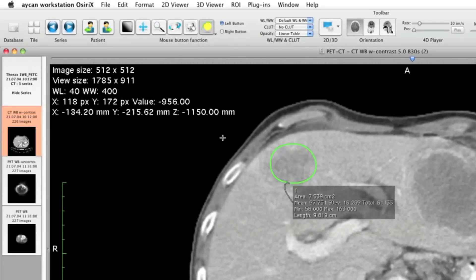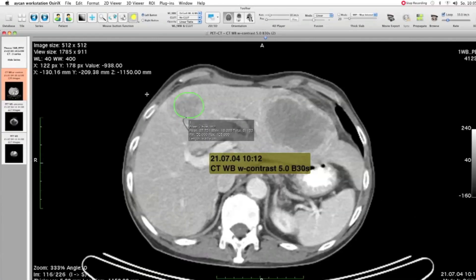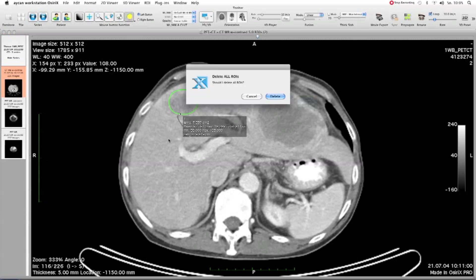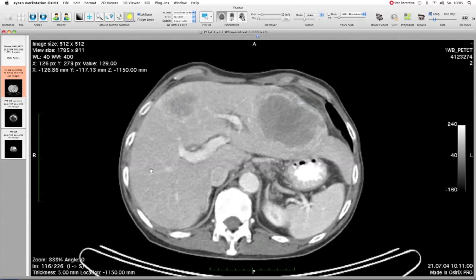Now I said you should watch first — now we will repeat it step by step. Please delete all your ROIs using the Command key (it's to the left or right of the space bar) plus Backspace. That will delete all ROIs.